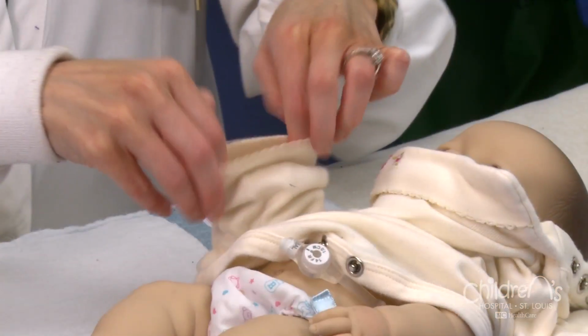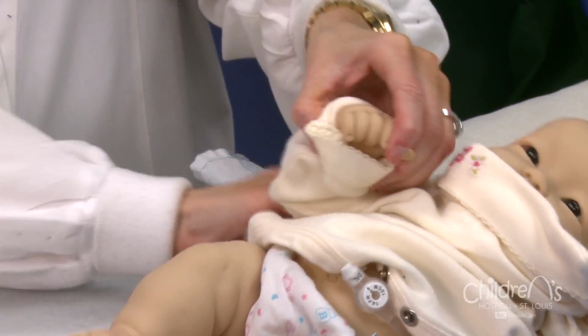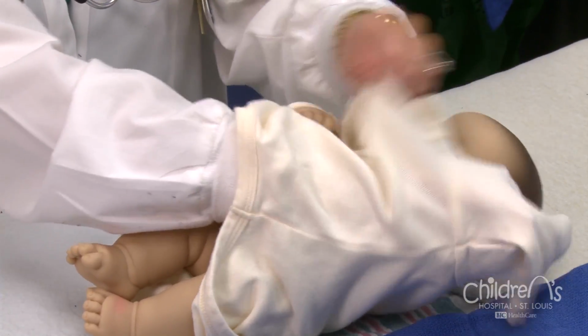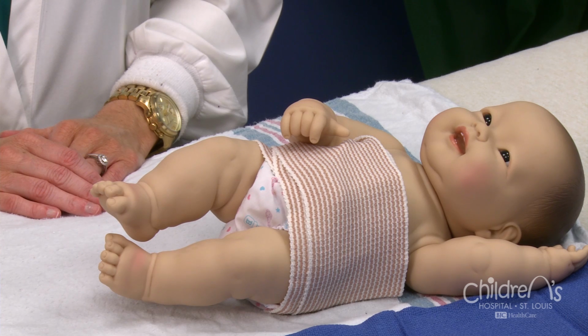Once your child is discharged from the hospital, you'll need to continue care at home. As with every medical device, there are some simple guidelines that should be followed. First, it is important to prevent the gastrostomy tube from being accidentally pulled out or dislodged. In order to prevent this, you may dress your infant in a onesie or place an ACE bandage around the abdomen in active toddlers and children.